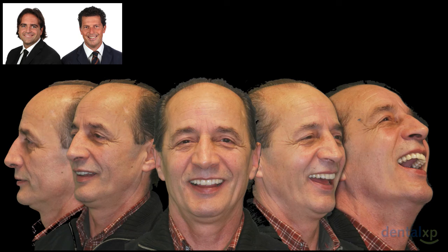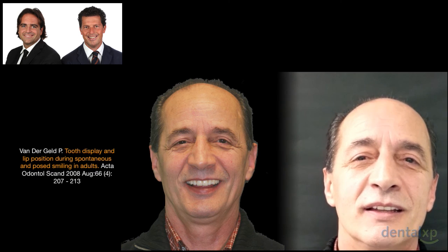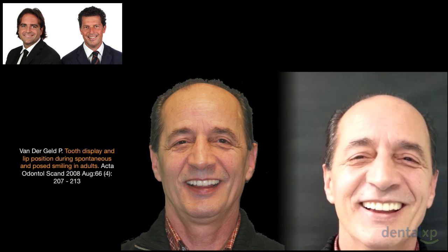And of course it's important to take this kind of picture, but it's important also to carefully check a video where we can evaluate the dynamic movement of all the facial complex of our patient. It's always important to see the facial complex, not only focus on the smile and on the teeth. The teeth have to work inside the face of our patient.